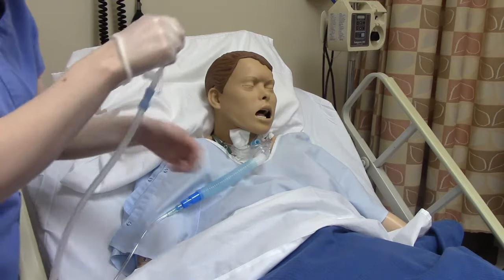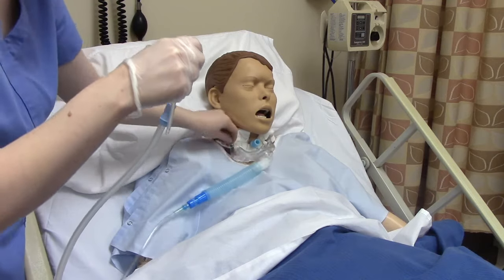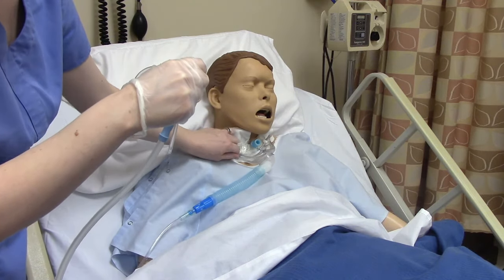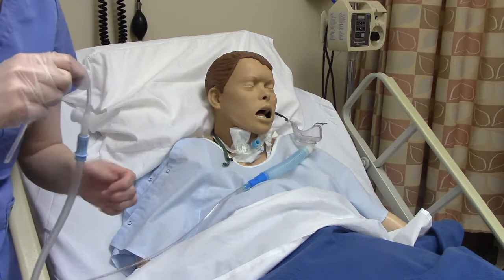We're going to temporarily remove our patient's oxygen using our non-sterile hand. That hand isn't dirty because we provided hygiene — it's just not sterile. So we're moving that trach collar off to the side.